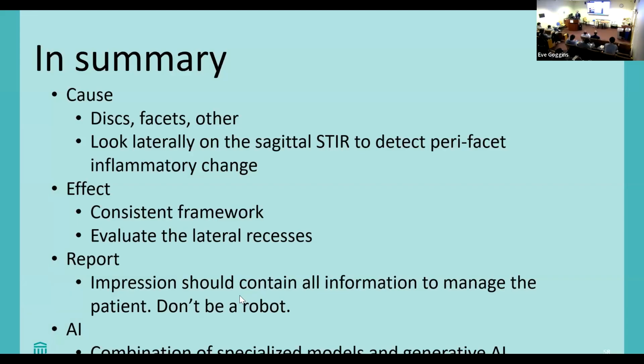And if a patient can't get an MR, it's very reasonable to try to read the CT with the same level of detail and consistency, but you would then just have to make accommodations because you might not be able to see all of the relationships as clearly as in an MR. I might say things like, there is at least moderate spinal stenosis, just put in little modifier words. You can't see exactly what I need to see.